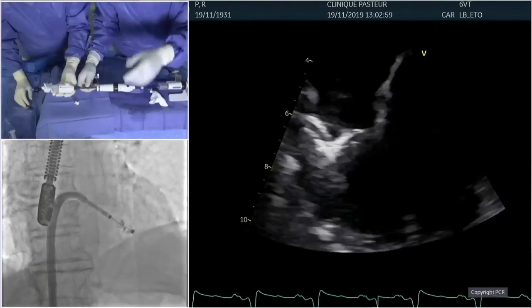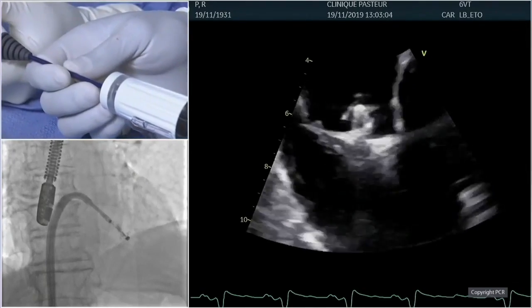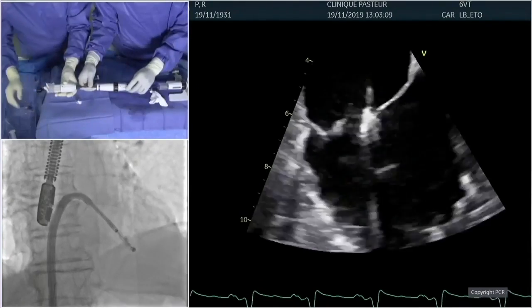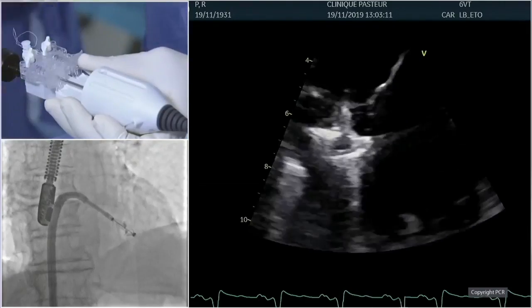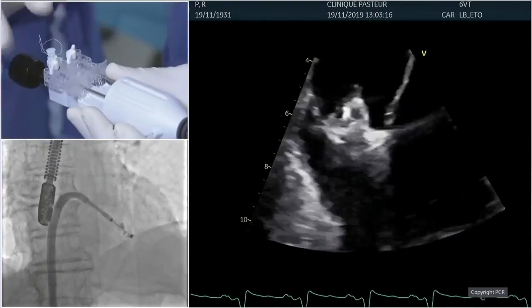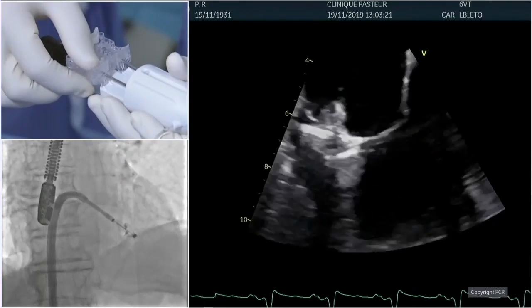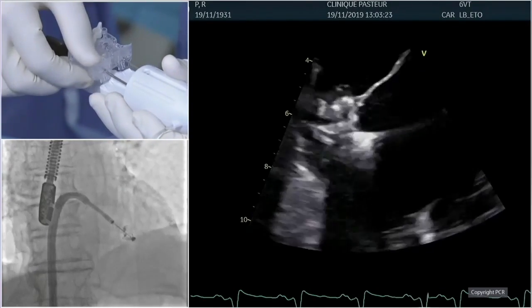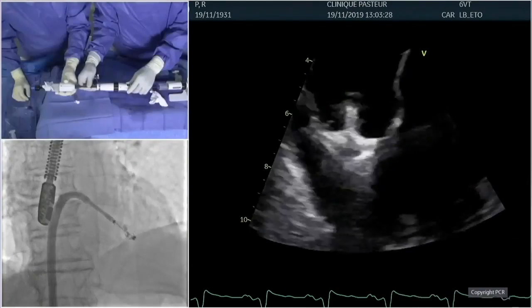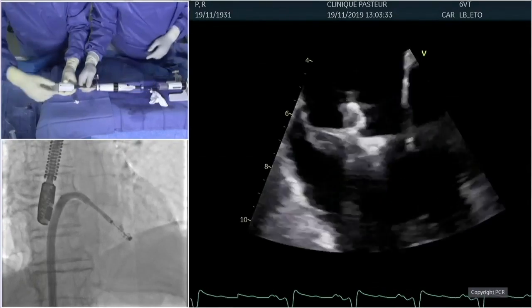And now we're going to correct anterior and try to. But we lost the posterior. Okay, let's do it again. Let's lift, and we're going to restart first the posterior. Maybe we don't have to fold too much the posterior, so that's maybe one of the reasons why we lose it. Okay, let's do it. Posterior clasp down. And we lose it. Okay, let's do it again.